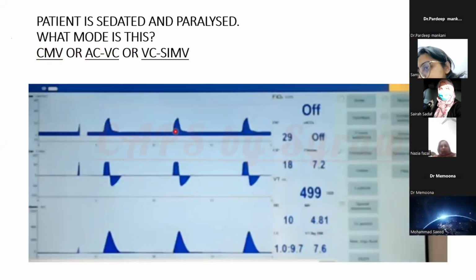I am having another question. There is a concept of high PEEP and low PEEP. What is the difference between the two? So the high PEEP and the low PEEP values are kept in the mode of Bi-level, which is a pressure controlled mode in the vent. And this is the same thing as high pressure and low pressure as in the APRV mode, or in the conventional BiPAP mode, where we term this as IPAP and EPAP. But it is the same concept. You have a higher pressure setting for the inspiratory phase and a lower pressure setting for the expiratory phase, but you have continuously positive pressure during the total cycle time.